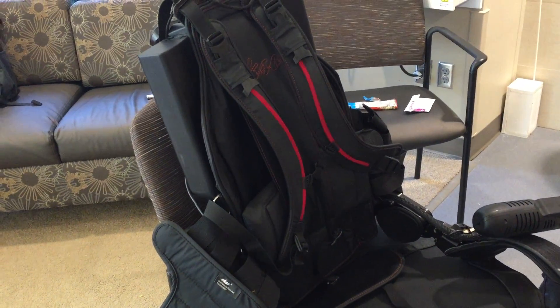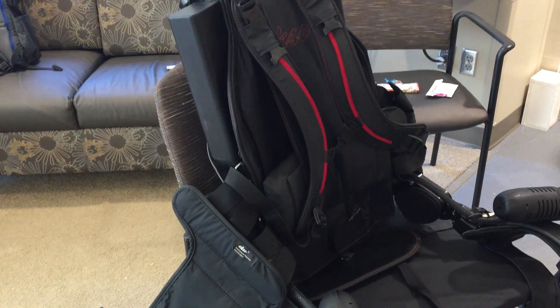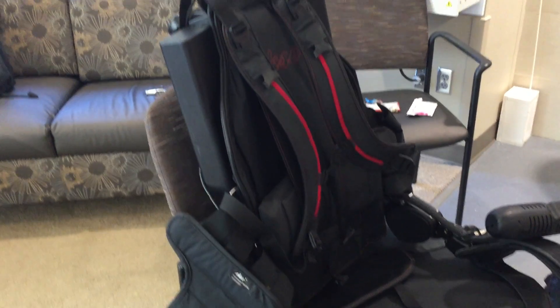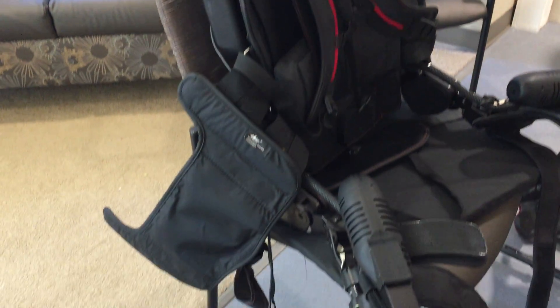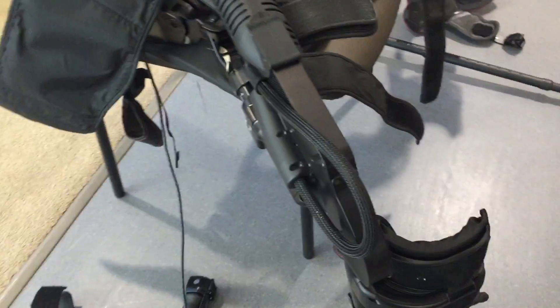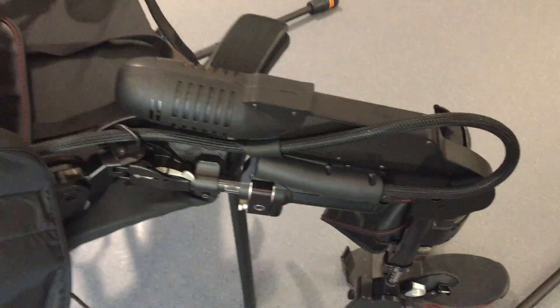This specific piece is a second generation exoskeleton. The third generation will hopefully be coming soon, but is still currently in the research space.